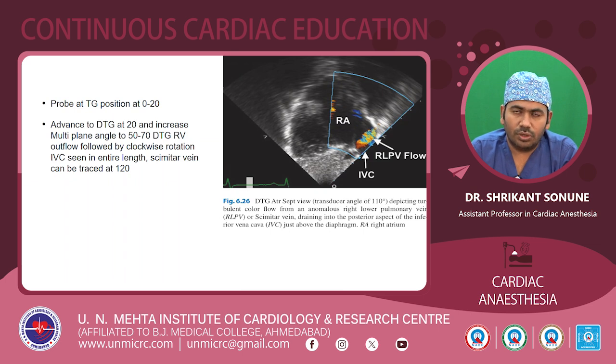To achieve this image, we first position the transesophageal echo probe at a transgastric position of around 0 to 20 degrees. Then at this position, we advance the probe to a level of deep transgastric, around 20 degrees, and increase the multiplane angle to around 50 to 70 degrees to achieve the deep transgastric RV outflow view.